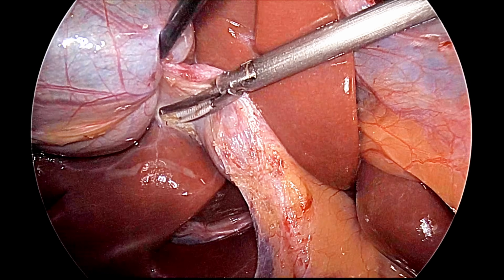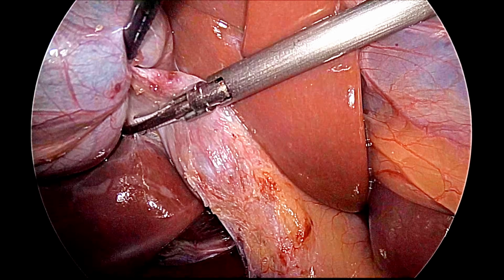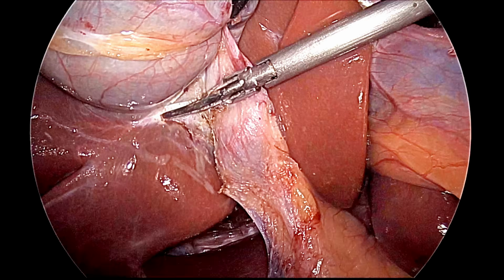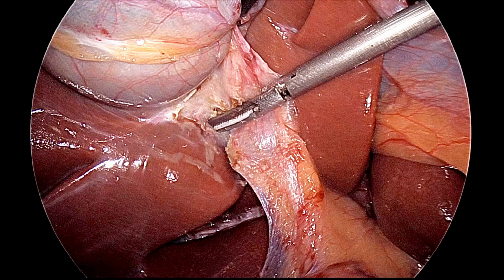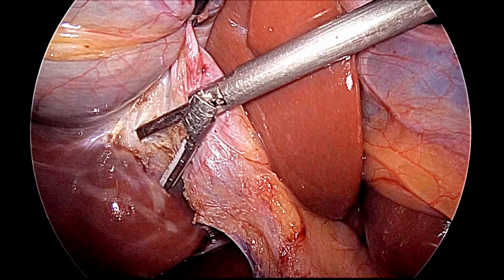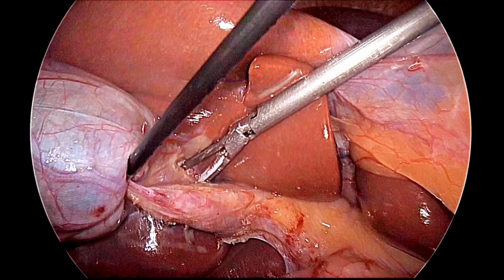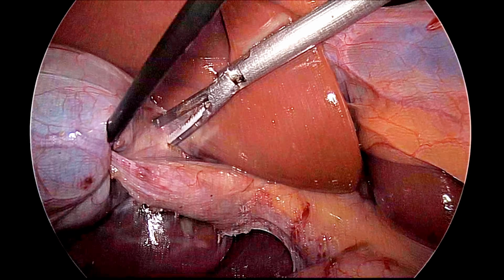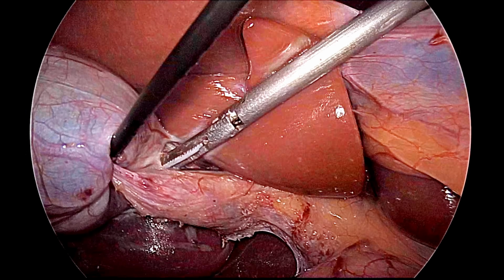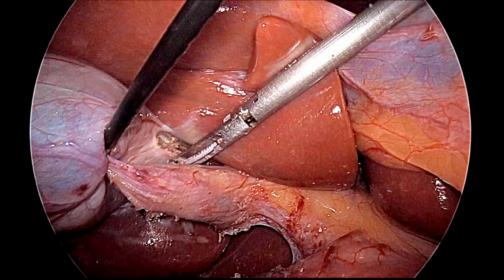With the Teflon jaw of the harmonic, you can give a little traction so that the gallbladder will not be punctured and the peritoneum can be easily separated up to one-third of the gallbladder. Now this is the anterior peritoneal enlargement so that the posterior window will be created. Then we can see the inferior surface of the liver is visible and the posterior window is created.